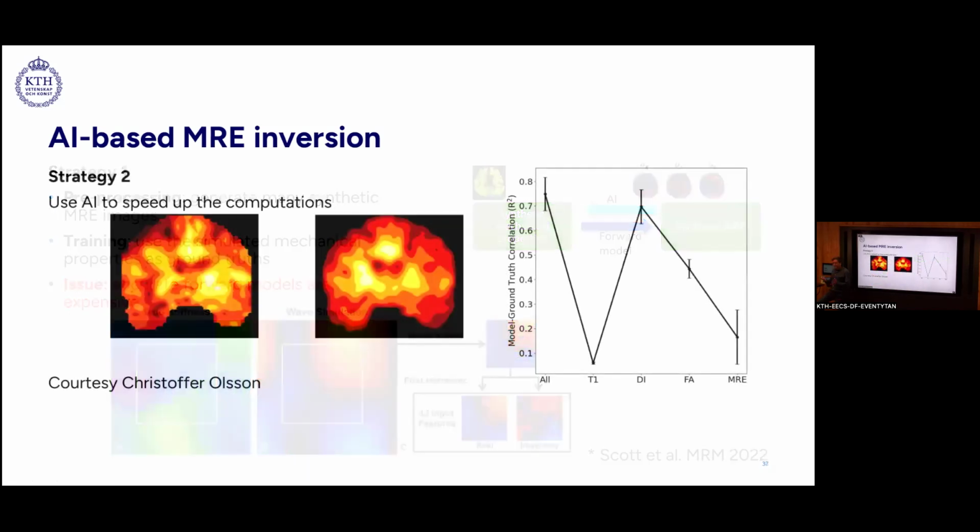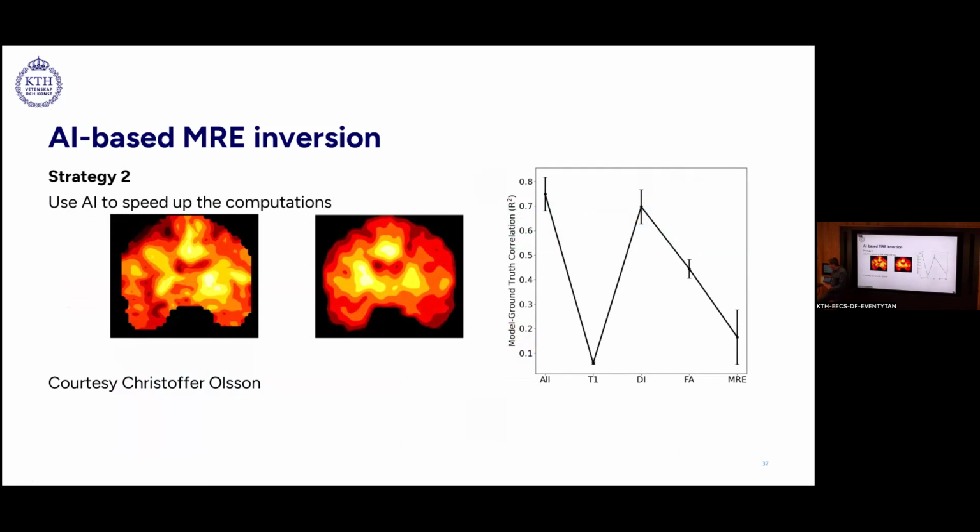Another very basic idea that we, of course, tried is just to use, let's say, a U-Net and then just use inputs and then simulate outputs. It works, but we were not really interested in this, but more in the ablation of what happens if you add more information or less information, which is more meaningful for the estimation of stiffness.